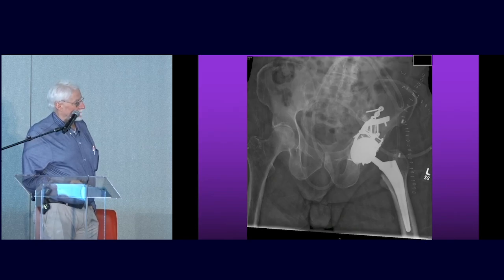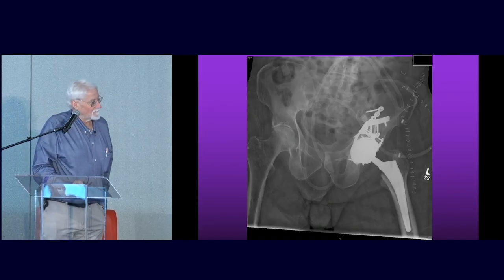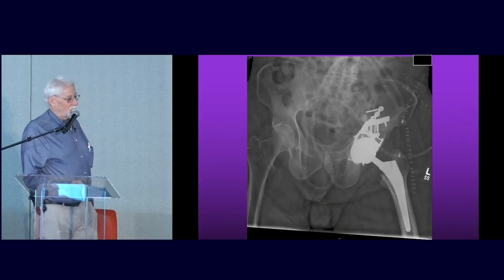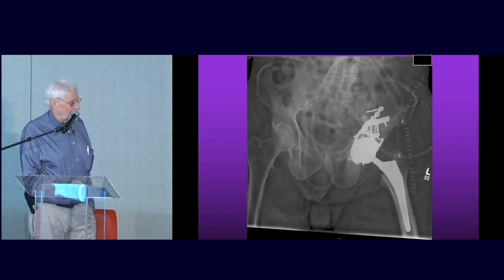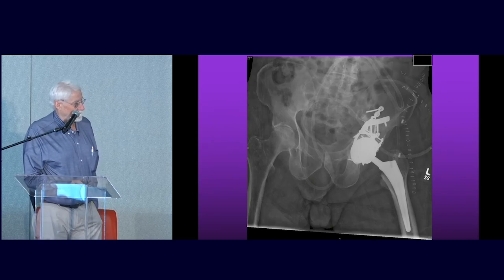And we often do that same thing. You can do a lot of the fixation in these anterior column injuries through the lateral window and just get it clamped, get it reduced. We've taken some of those big plates and bent them over and pushed against the quadrilateral surface. Now you've got the anterior intrapelvic approach and those fancy quadrilateral plates, but we've done this quite a bit. And you can do that anterior column fixation in a half hour in a lot of patients. Just that lateral window is easy to access and fix. And if you're fast, I'll sometimes get an anterior column screw down there too.